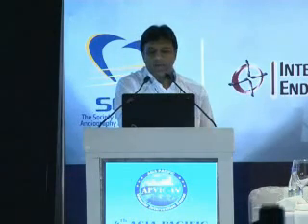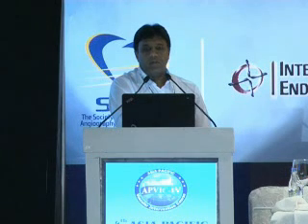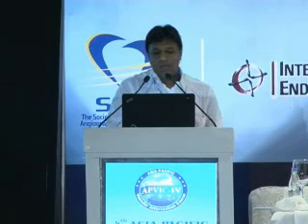An ideal catheter should be able to sustain high pressure injections, track well, be non-thrombogenic, have good memory, and torque well. Length depends on the location of use, and sizes are 5 to 8 French. For the abdominal aorta, 60 to 80 centimeter length is sufficient. These are the types of catheters.